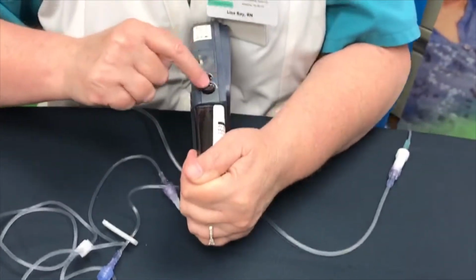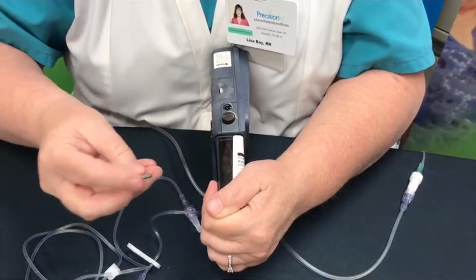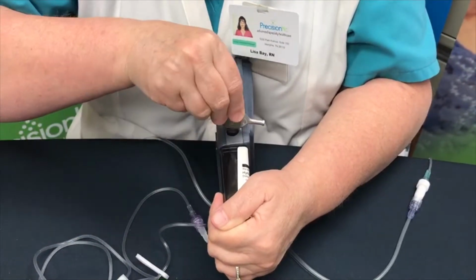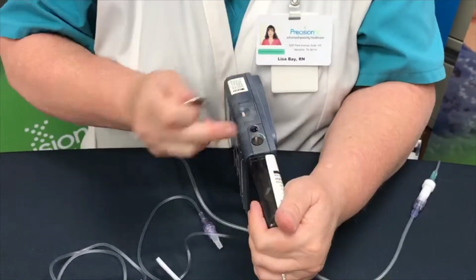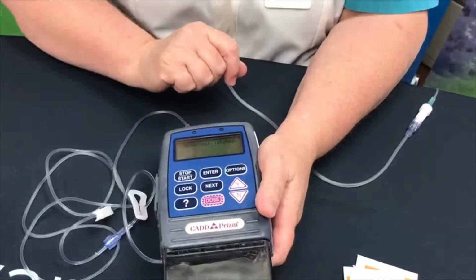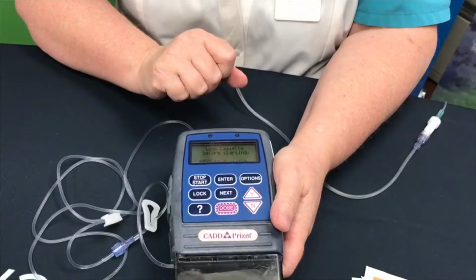We want to turn this key from horizontal to vertical. We're going to do that by using the side of our CADD pump key. Place that in, press it down, and turn it until it is completely vertical. If it's in the correct place, it's going to say that the reservoir is latched. Now it's going to say that I need to lock the cassette.